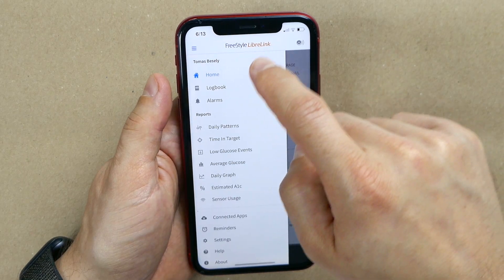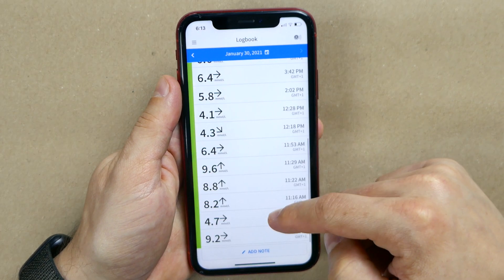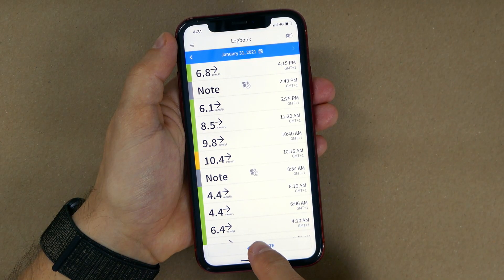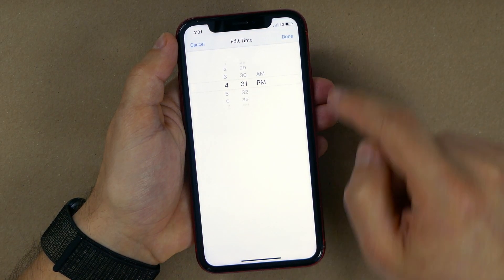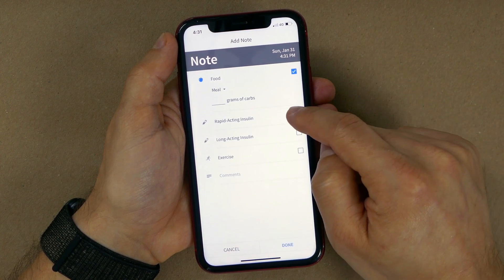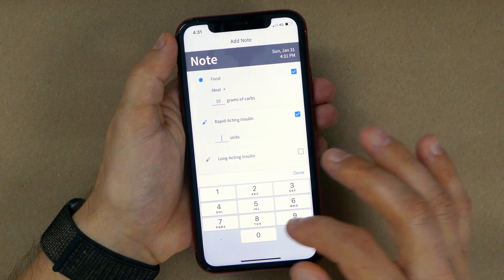Let's go through the LibreLink app step by step and I'll show you how I use each functionality. First is Logbook. Logbook gives you a simple overview of all your sensor scans, showing your blood sugar value and trend at the time of each scan. You can add notes anytime you eat, take insulin, or exercise — noting exactly how many carbs you ate and how many units of insulin you took. When I really push myself to take these notes, I get great insights that help me fine-tune my boluses and avoid blood sugar spikes after meals.